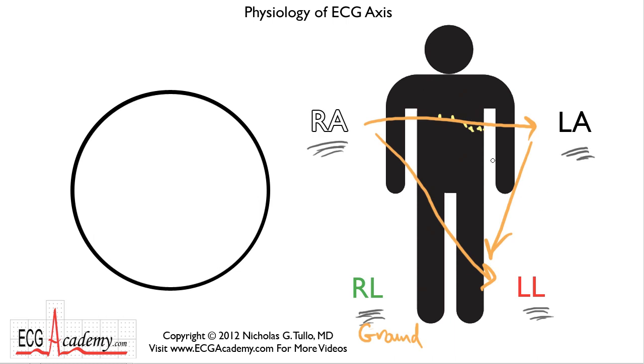Well, we generally don't think about triangles when we talk about axis. We think of a circle. You'll just have to remember the angles that we talked about. Now, the circle is divided up into 360 degrees, with 0 degrees being defined as this point on the right-hand edge. Lead 1, of course, is pointing toward the 0-degree angle. If the axis is located in this direction, the degrees are expressed as positive degrees. And if the axis points in this direction, then by convention we use negative degrees.